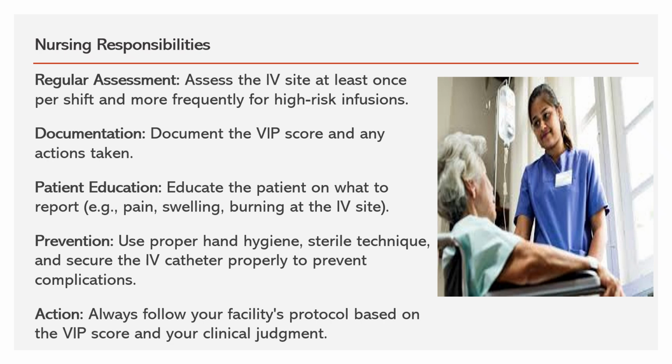If you are giving these, we should observe at least every 2 hours, because there is a chance a blockage can happen and then swelling and redness will follow. So to avoid all of this, we should check the patient's IV site every 2 hours if we are giving concentrated electrolytes to the patient.